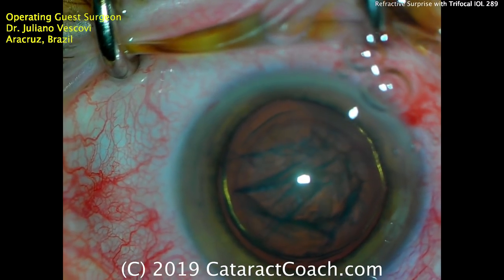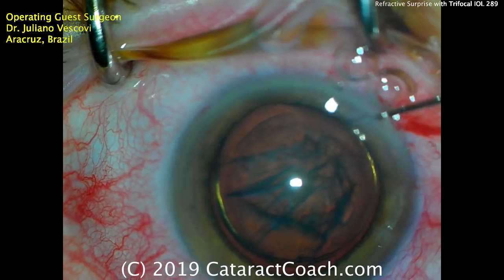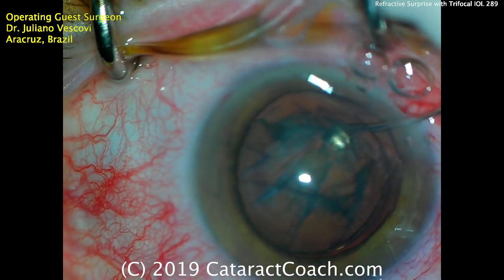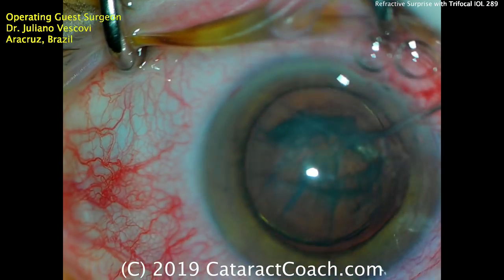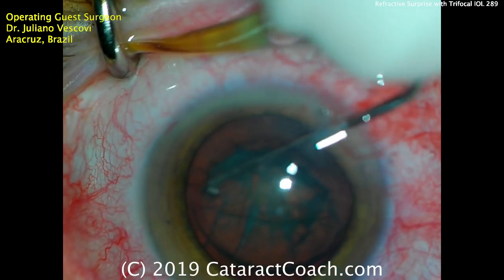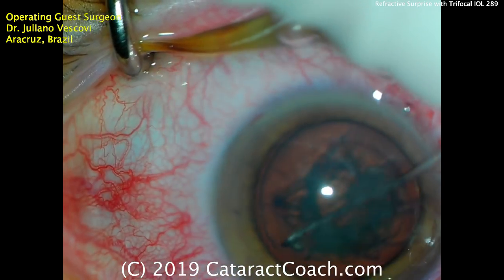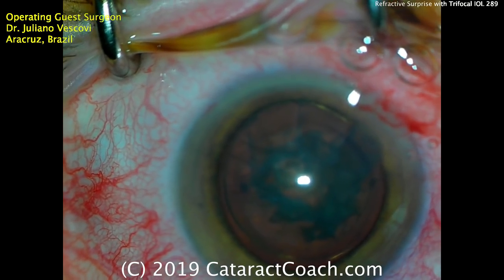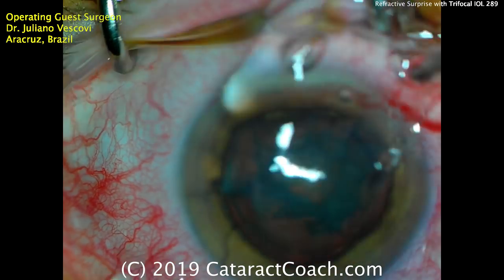A little more viscoelastic added in the center — a very advanced move to protect the endothelium, because during hydrodissection and hydrodelineation you can lose a substantial amount of viscoelastic, so adding a little more is helpful. Now we can see complete rotation of the nucleus in the capsular bag. That's really going to facilitate the nucleus removal.